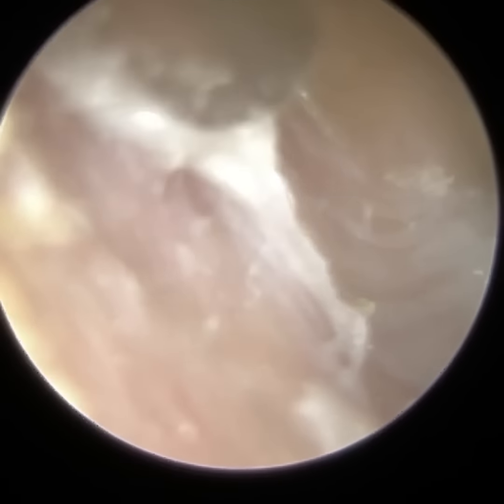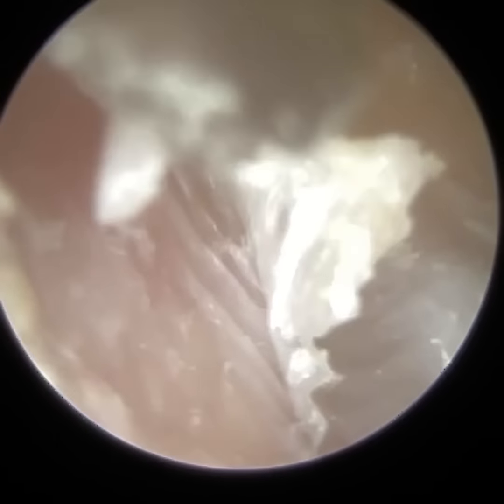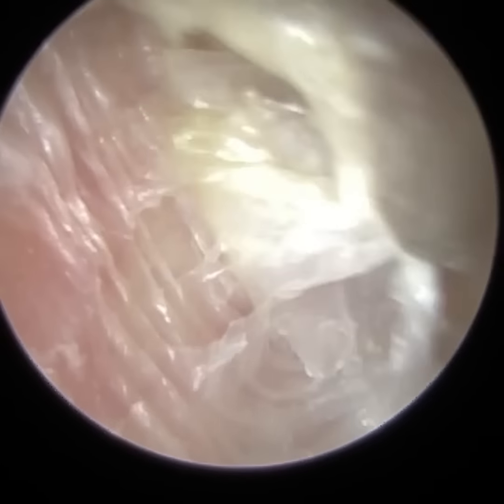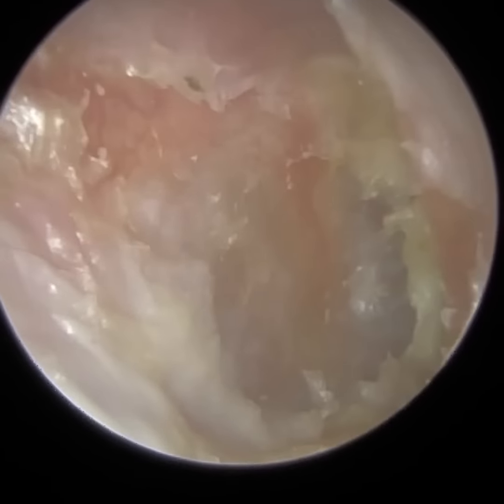So sitting on the surface of the bone, all across the body really, are specialized cells called osteoclasts, and when you initiate those, they break down the bone into its core minerals and tissues, and then redistribute those minerals and tissue via the bloodstream to other parts of the body, where another type of cell called osteoblasts form new bone. So there could be some bony remodeling occurring on the posterior canal wall, just there where we're examining.